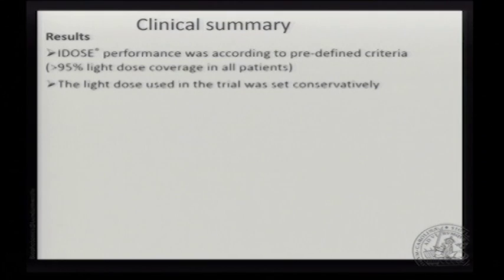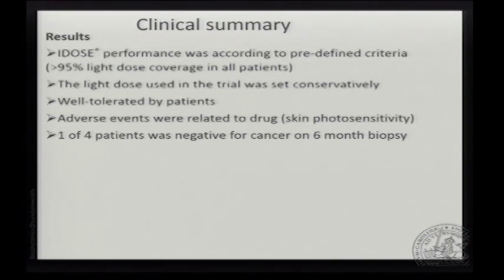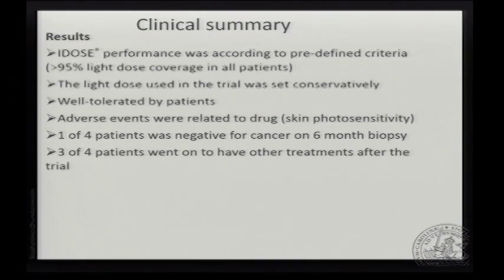As I said, we set the limits very conservatively. It was very well tolerated by the patients. The only side effect that we had was skin photosensitivity that we could already count on beforehand. So one of the 4 patients actually came out without any cancer afterwards. The other 3 patients were treated with other modalities.